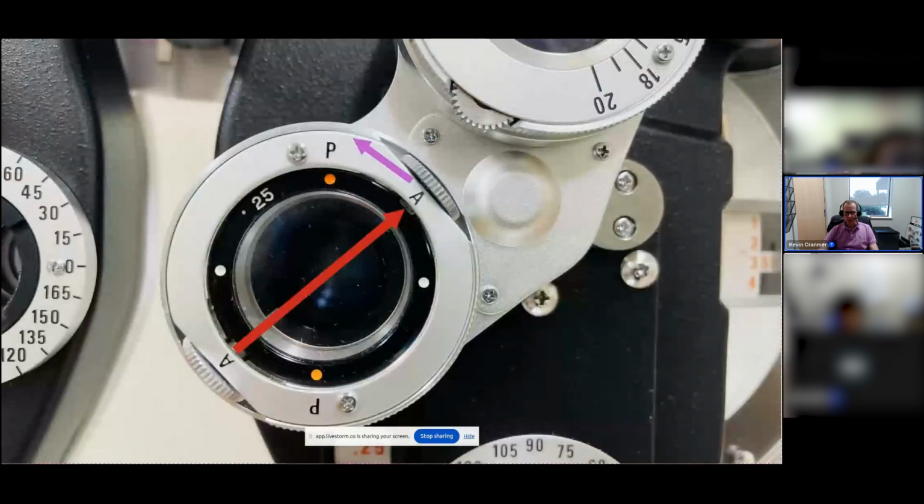So what we're going to do is flip this lens back and forth, and we're going to ask the patient, which is clearer, 1 or 2? We flip once, we show them 1, we flip again, we show them 2. And you can go back a couple times if you need to. Which is better, 1 or 2? And the patient will tell you they're either equal, or 1 is better, or 2 is better.